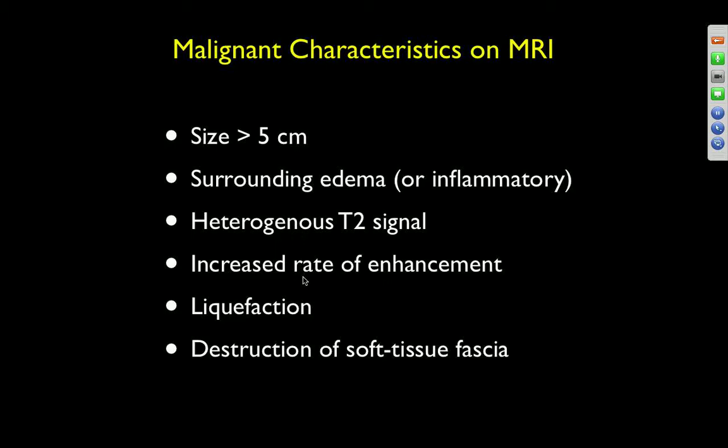If you do MRI perfusion studies, where you look at enhancement within 1 minute of injection of the contrast, early enhancement tends to be associated with acute inflammatory disease and or malignant disease, whereas benign disease, if it enhances, tends to enhance later than the 1 minute phase.